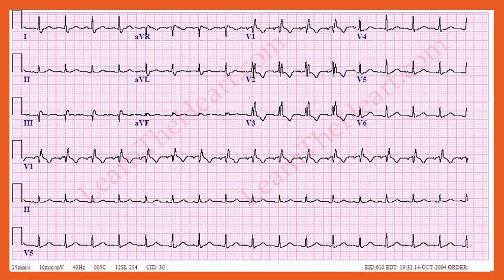Okay, when we look at the bottom, we can see in lead 2 here running along the bottom, a P in front of the QRSs. Not a super duper lovely looking P, but it's there. We have a P in front of every QRS. Then we go up and our eyes shift to the right and left chest leads. So we go right for V1 and left chest lead is V6. So we see that our QRS complex is a little bit at or more than 0.12.